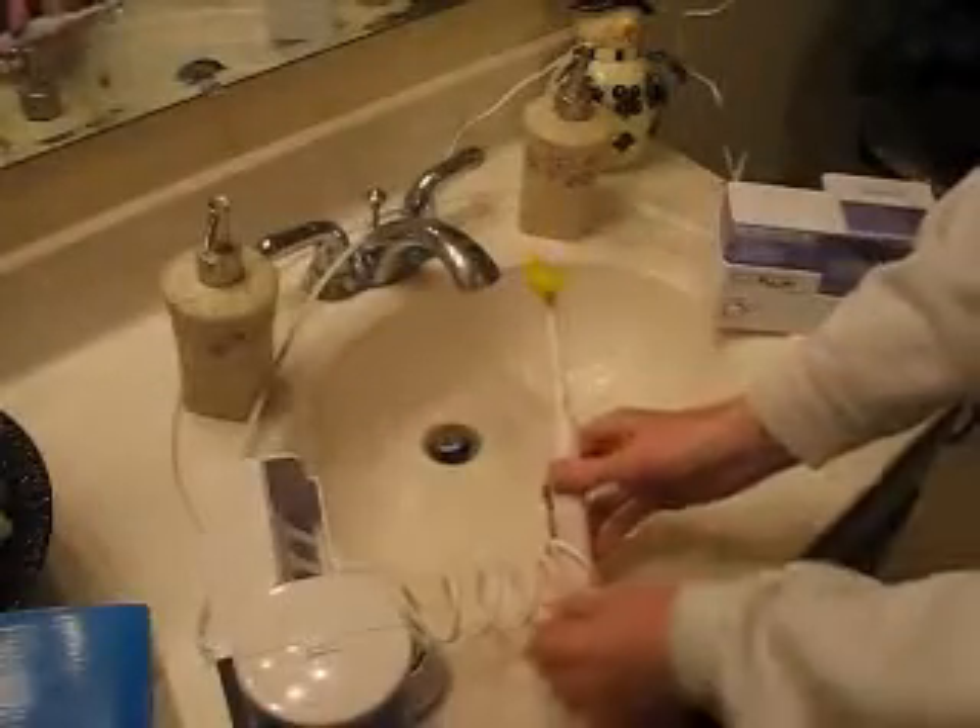It's a thinner plastic compared to the older one. We've traveled with the older one and it's stood up to the rigors of travel. The newer one also has a more compact design.